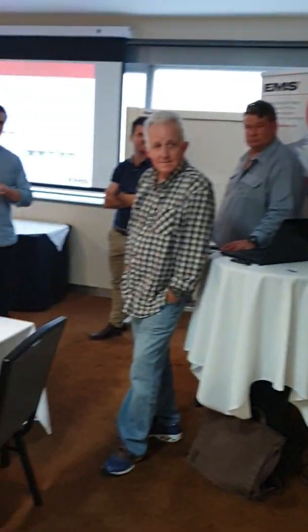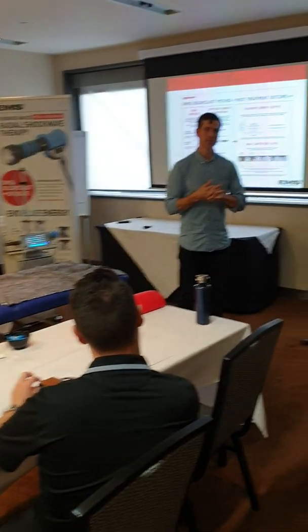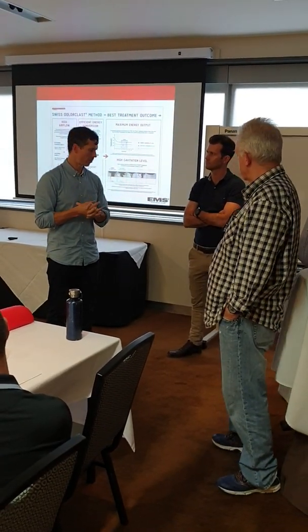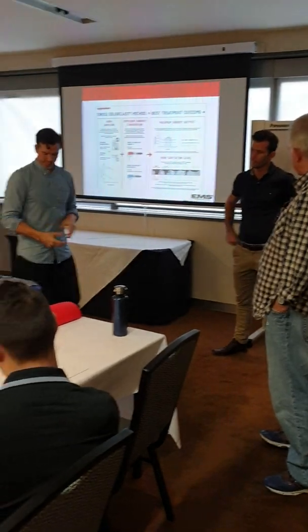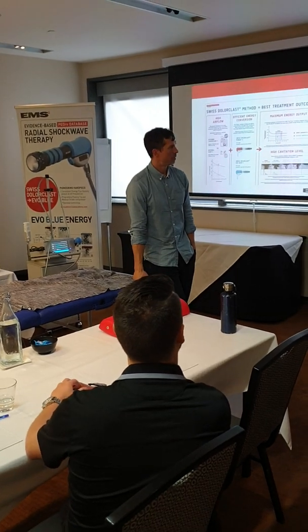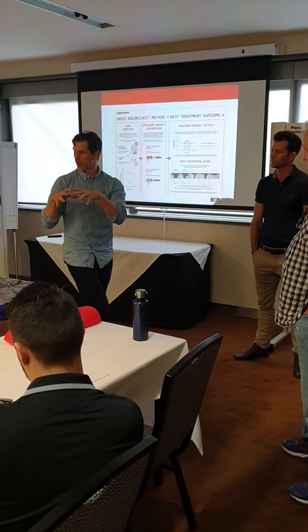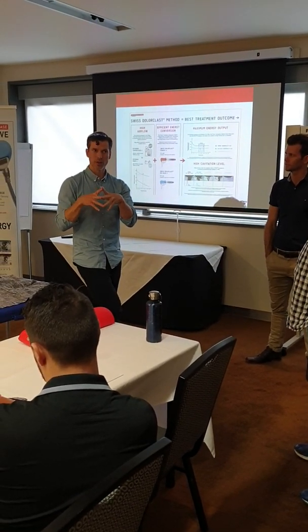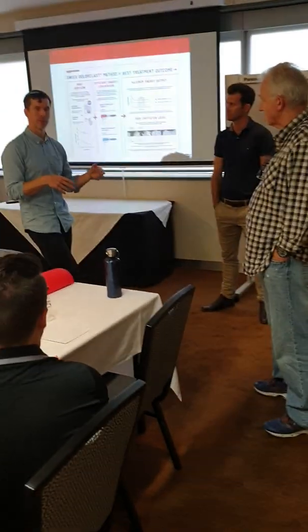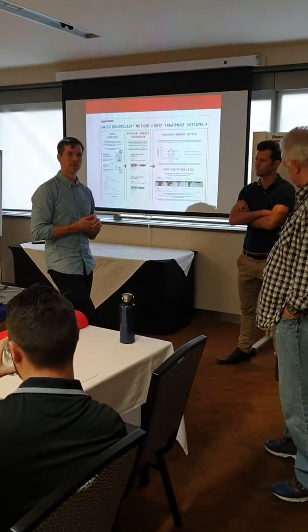If Finn's your typical patient, he feels good after he's had the Dolorclast done. If he goes and runs 20 Ks, what's going to go? His calf muscle belly, or is he going to reignite the Achilles? Do you have to rehab the calf muscle as well? Because for the last 3 years he's been getting around with a compromised Achilles. What I'm teaching here is more symptom treatment. If he was my patient, I'd be assessing his foot, ankle, knee, hip, and pelvis, making sure all the mechanics are proper.